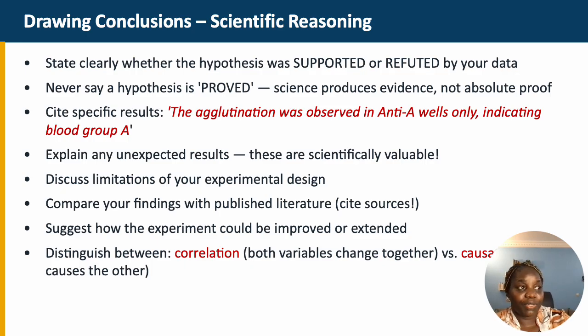This is how you can address a limitation or an unexpected result. In that particular experiment we are focusing on pathogens, so not the classical pathway but other pathways involving pathogens. That's why I'm taking this example. So that is a scientific conclusion.